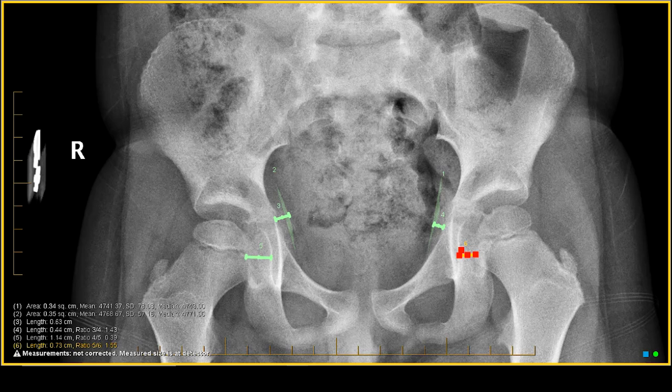In the next vignette, we're going to show you what this looks like on MR imaging.